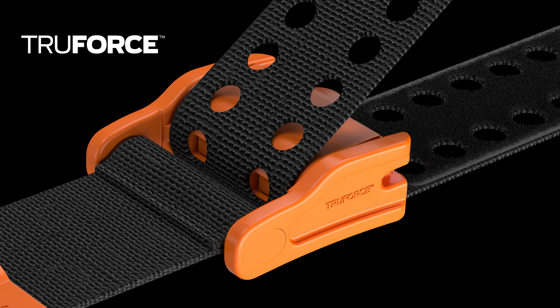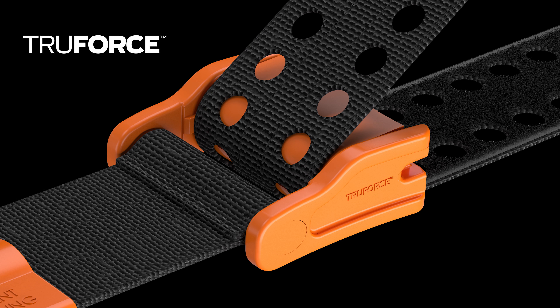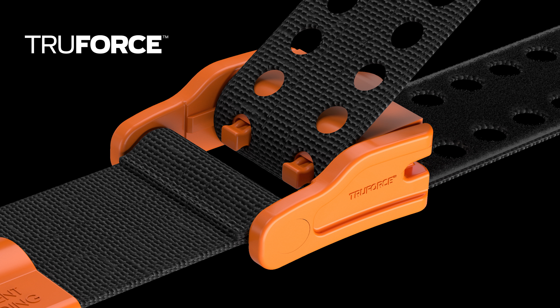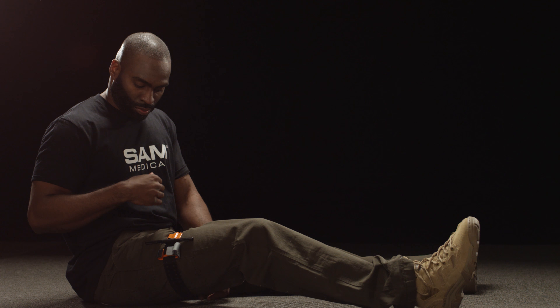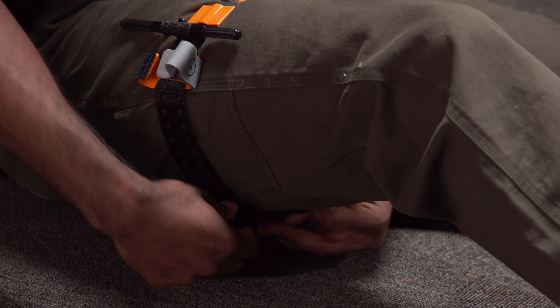The True Force buckle technology auto-locks by activating prongs, eliminating slack typically found in all other tourniquet applications. Maintaining tension, press the strap back upon itself to attach it in place.